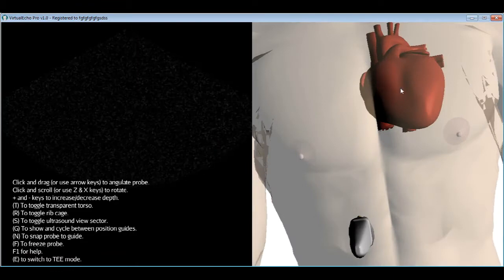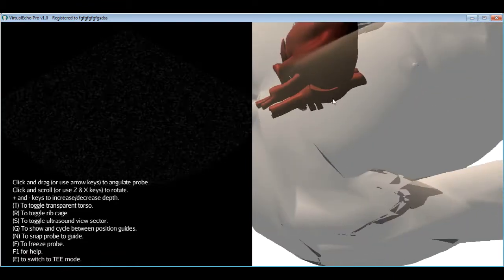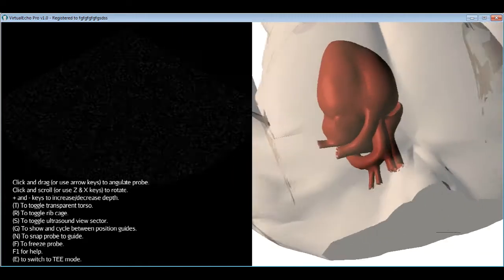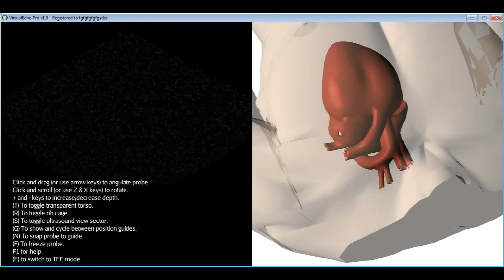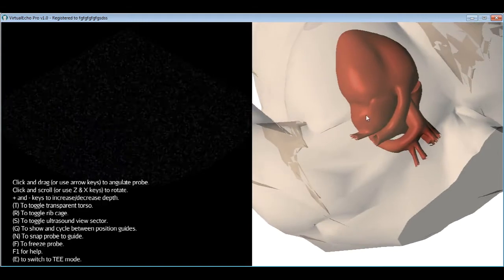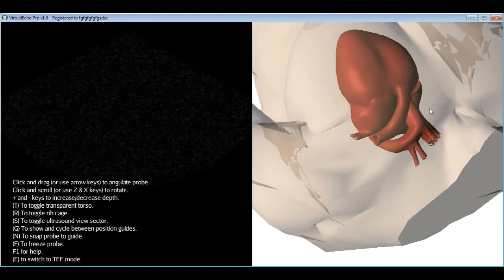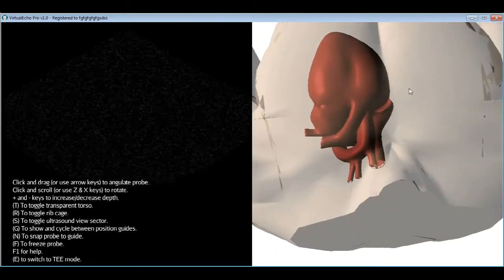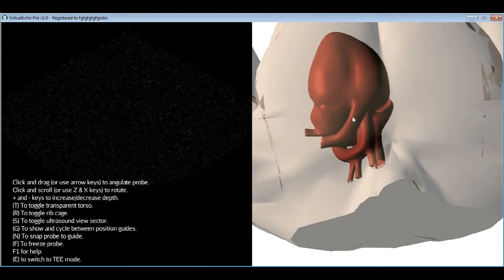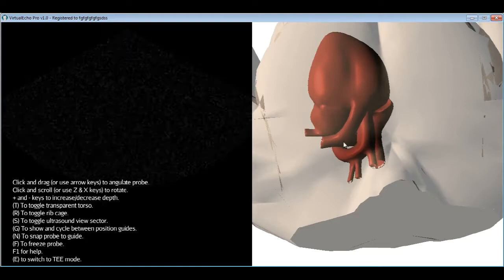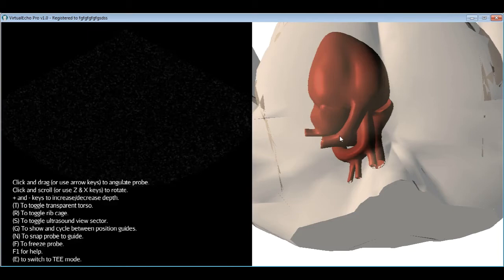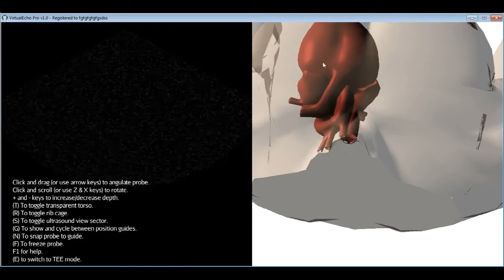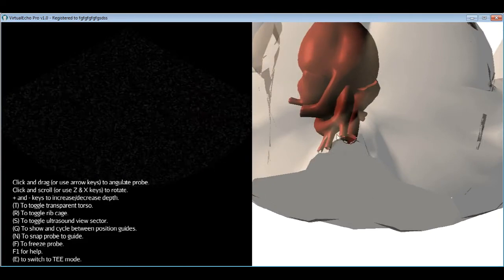The right ventricle and right atrium are separated by the tricuspid valve, while the left ventricle and left atrium are separated by the mitral valve. The left atrial appendage is a small projection from the left atrium, and the pulmonary veins also enter the left atrium. The big vessel coming out of the RV is the main pulmonary trunk, which bifurcates into right and left branches. The aorta exits the left ventricle behind the pulmonary artery.